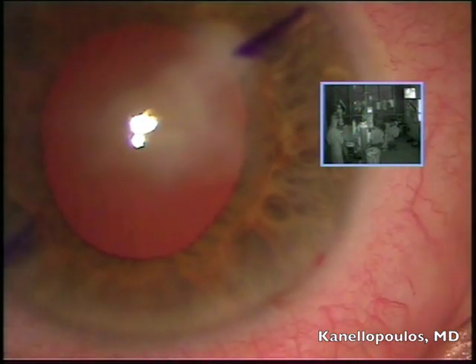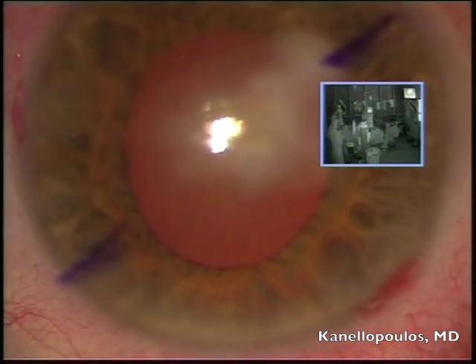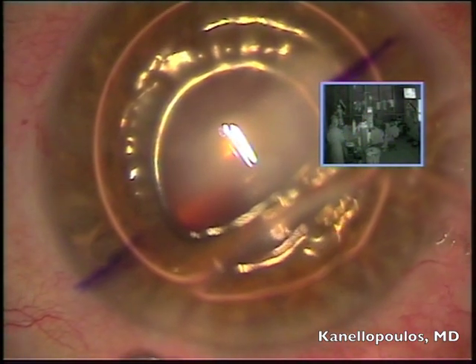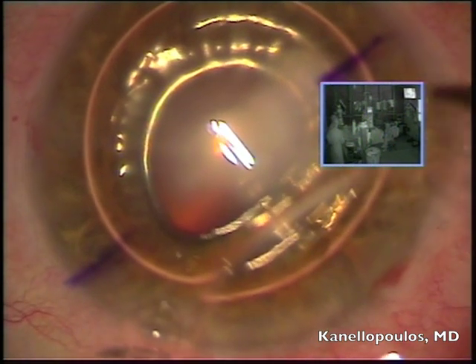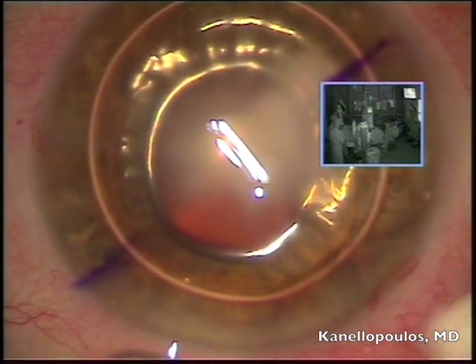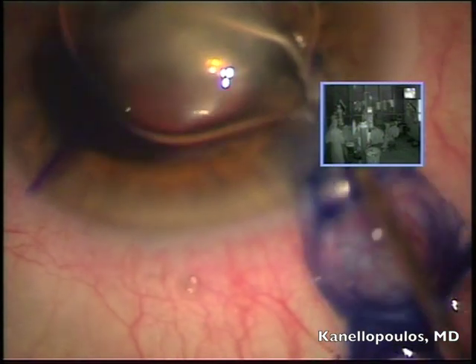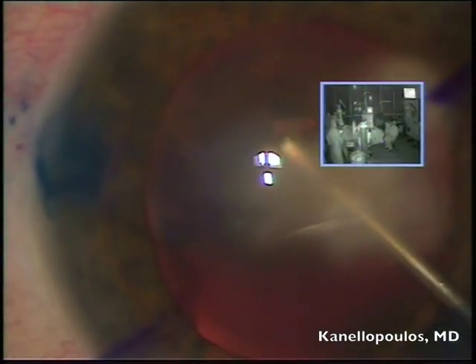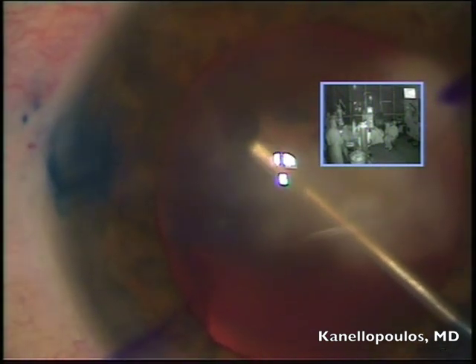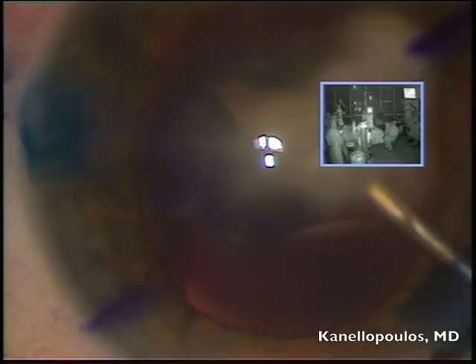There's a very small pupil for the density of the cornea scar, which is central, so I'm going to maximize my visualization. Peripheral to the scar, I'm putting air in the eye. You're guessing correctly because I'm going to follow with blue dye to stain the anterior capsule, maximize my visualization, and of course tighten the anterior capsule, make my capsulorhexis easier. I'm nicking here the capsule with a cystotome, unfortunately right at the area that is most difficult, and then I'm going to enter with the utrata forceps.